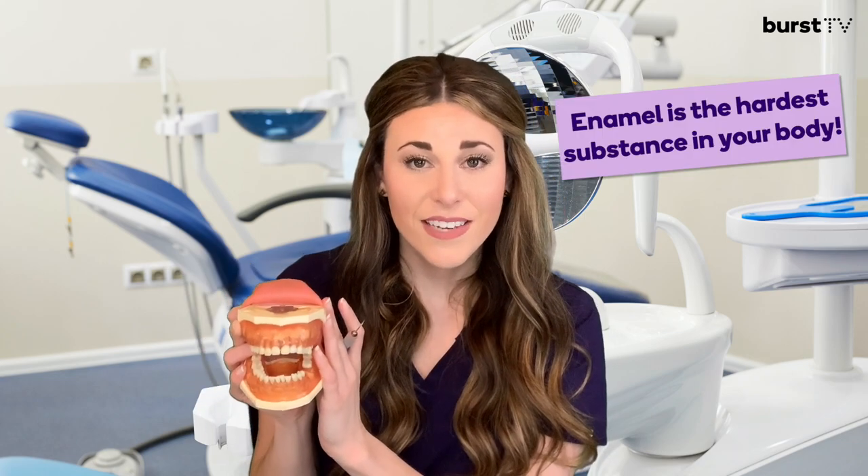Fun fact: the enamel on your teeth is the hardest substance in the human body. In my opinion, the second most common assessment instrument is the periodontal probe.